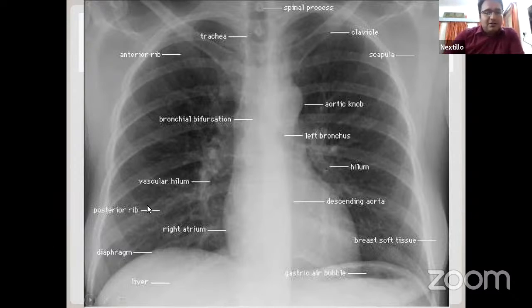And like in this part, there was homogeneous opacification and there was blunting of CP angle. I was very happy, sir, pleural effusion, hardly fifth or sixth day of my residentship, because at that time I was also new for the radiology. And what happened, I just missed that this patient, that was a female patient, had a missing left breast shadow. That was an operated case of CA breast, and I have missed multiple findings of that. But if I would have seen that properly by the scheme, okay, I will do this, I wouldn't have missed that. But let's see, it's fine.